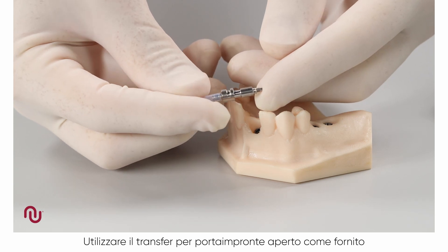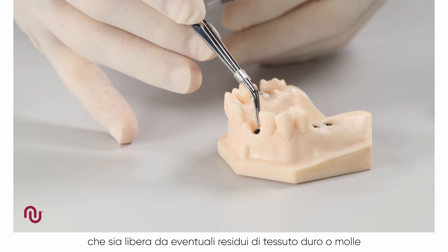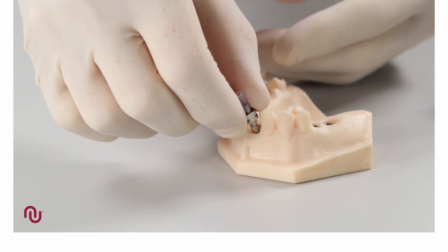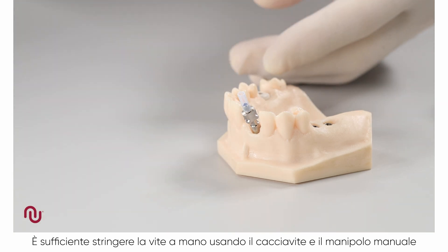Use the open tray impression coping as supplied. The implant connection is exposed and we make sure it is clear of any soft or hard tissue. Place the desired length impression coping onto the implant and tighten the screw. Hand tightening is sufficient by using the screwdriver and manual handle.